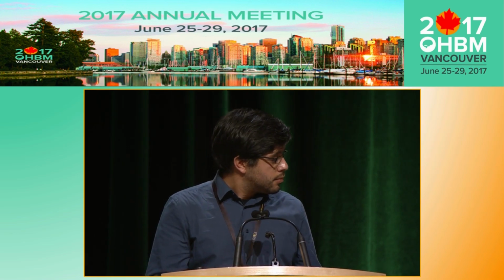Great. And then I guess very quickly, the other question that I had was, when you talked briefly about trying to go to multi-shell, how important do you think it's going to be to keep the diffusion time fixed? Because obviously it'd be nice if, when you're doing lower b values, you could reduce the diffusion time as well, because you'll get some SNR out of that. But then it has the problem that you're not quite looking at the same diffusion process.